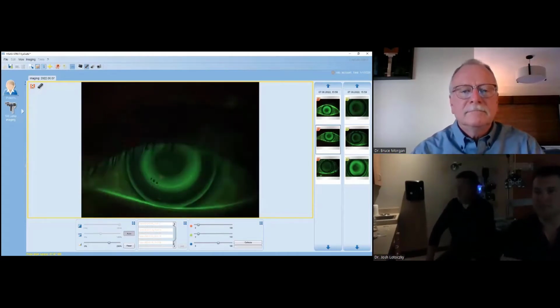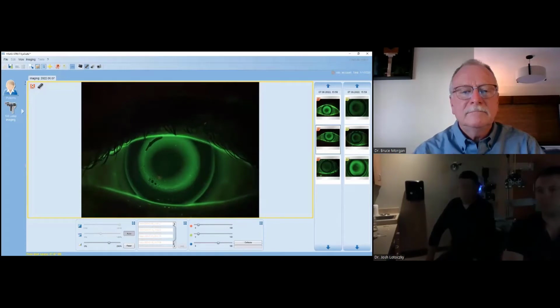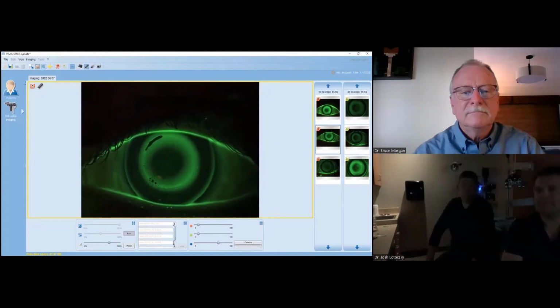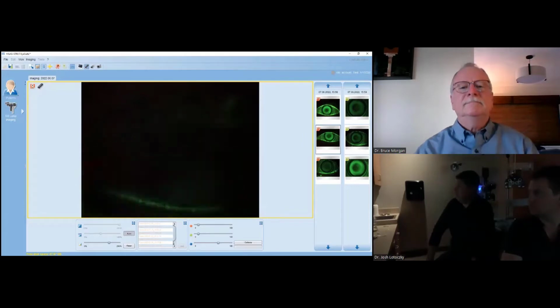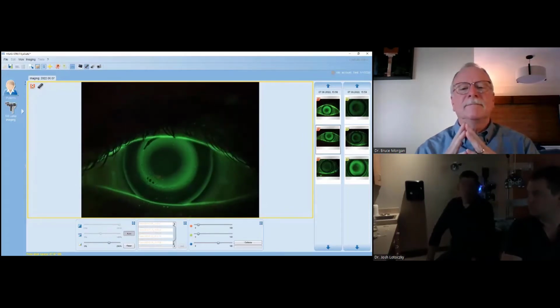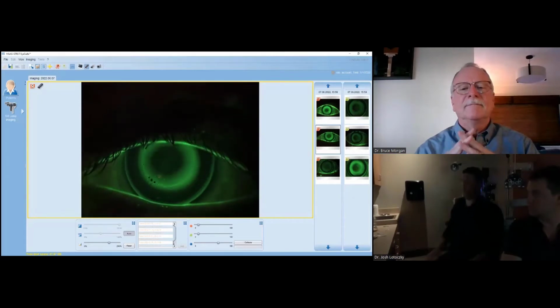The other thing to think about is we're using fluorescein tonight because the patient's been sitting behind the slit lamp for extended periods of time. That'll soften the epithelium. That'll make some of this dimple veiling a little bit easier to occur. So don't get too upset about that either. The bubble's getting a lot smaller than what it was before. We're losing them. So that one's coming in pretty good.